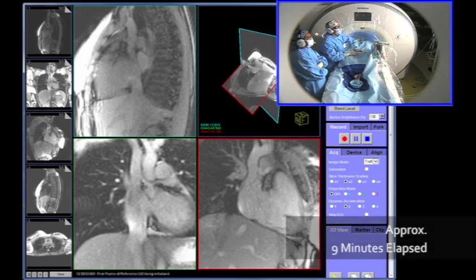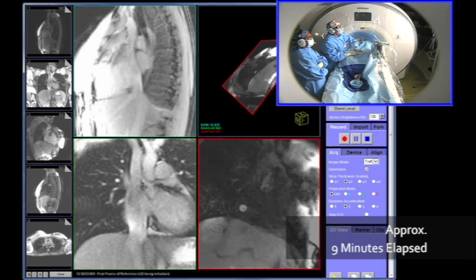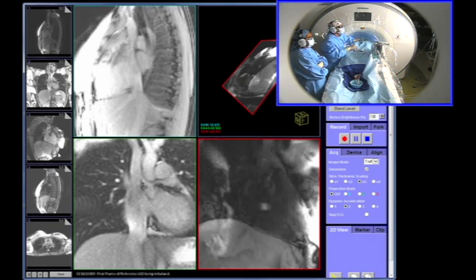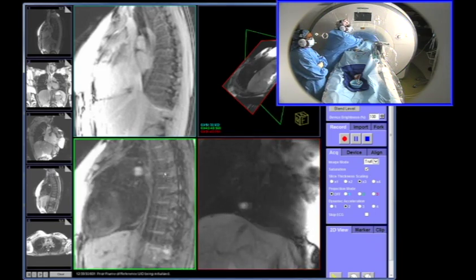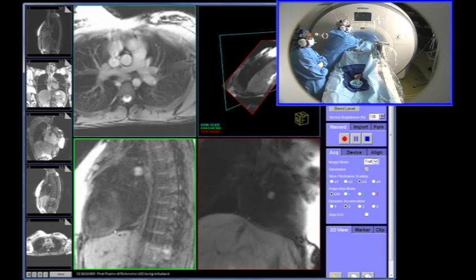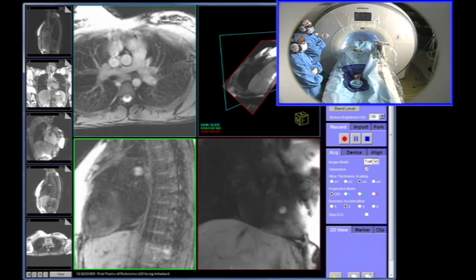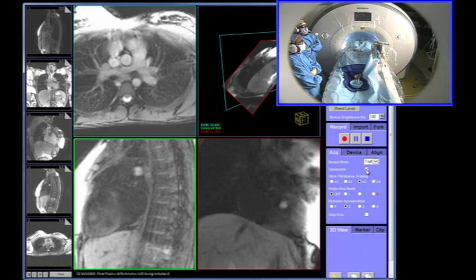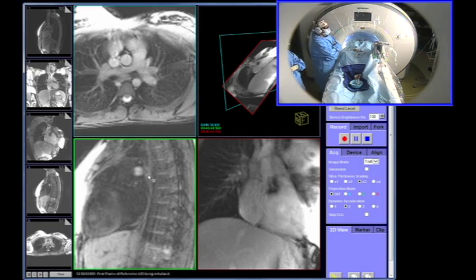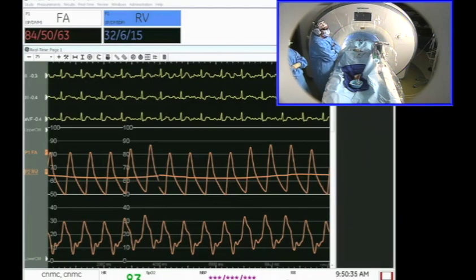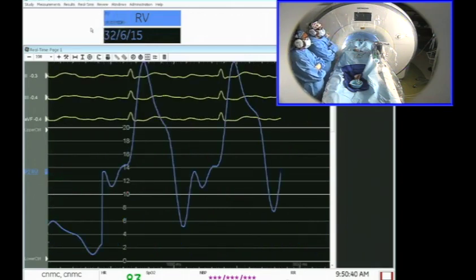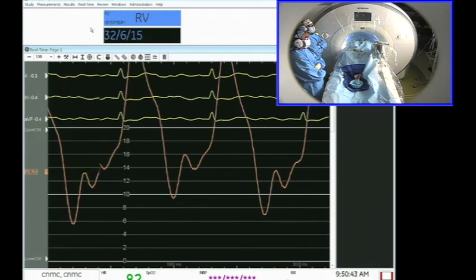Scan on. Scan off. Let's do slice thickness three. There you can see the balloon bouncing around in the right atrium. There we are in the right ventricle — scan off. One of the challenges of this, in contrast to a usual fluoro-based cath, is I can only see the tip of my catheter and not the whole shaft. But by changing the slice thickness and the acceleration, we can optimize the imaging to really navigate through the right heart.